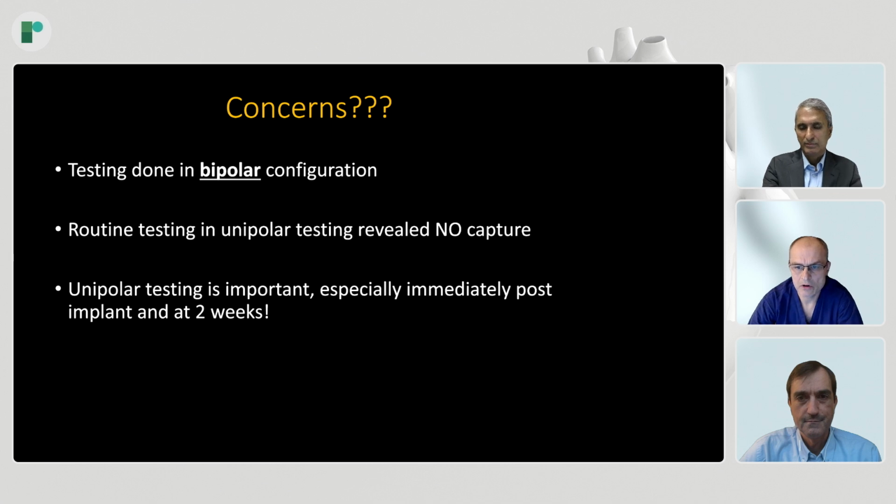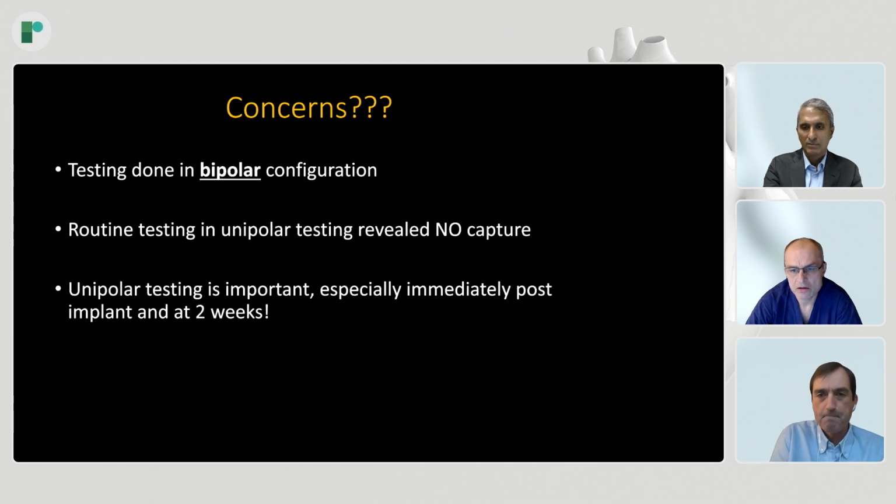At the end of the procedure, all patients are programmed to unipolar pacing just to avoid this masking of loss of capture from the tip on the next day. And all patients have an obligatory threshold test the next day, apart from the chest x-ray. So this is how we have found 2 late perforations in our cohort of 2,000 patients. So far this works well for us. No really late perforations were observed apart from these 2 next day cases.